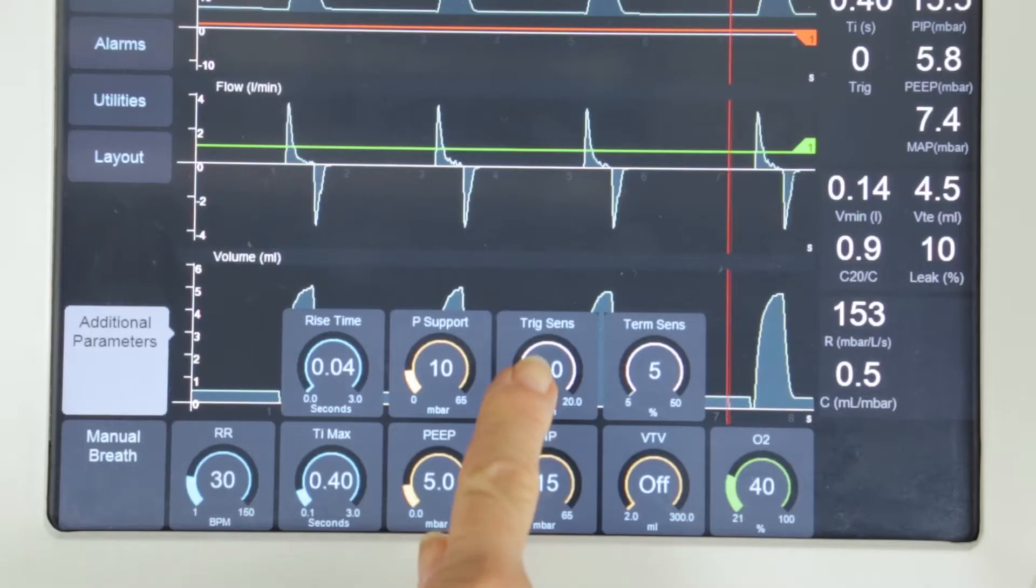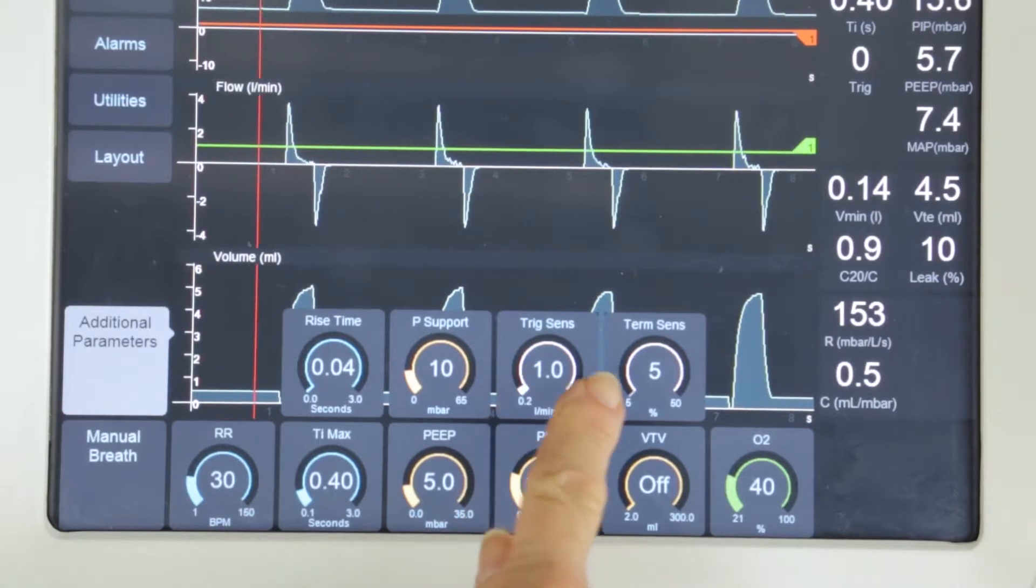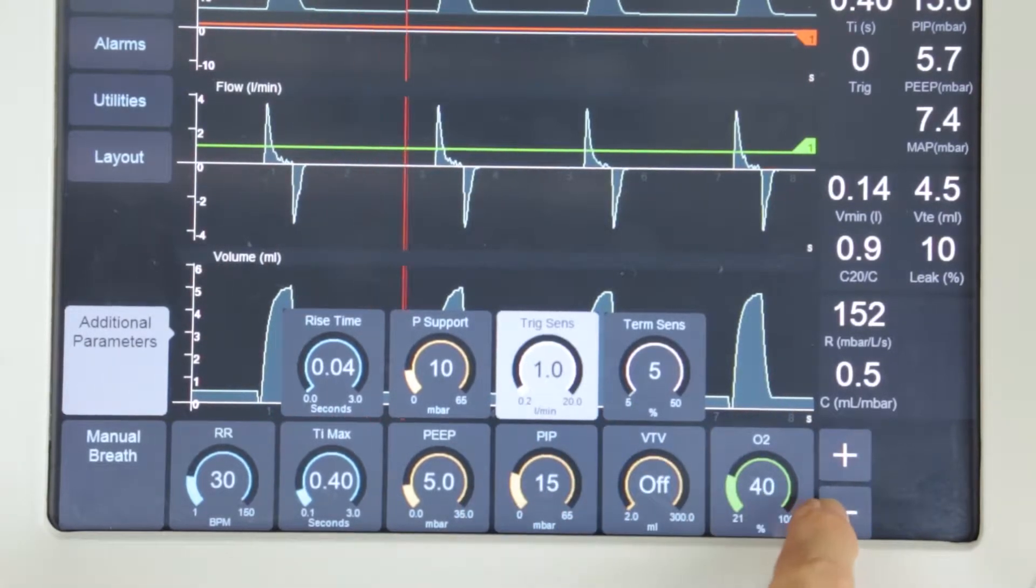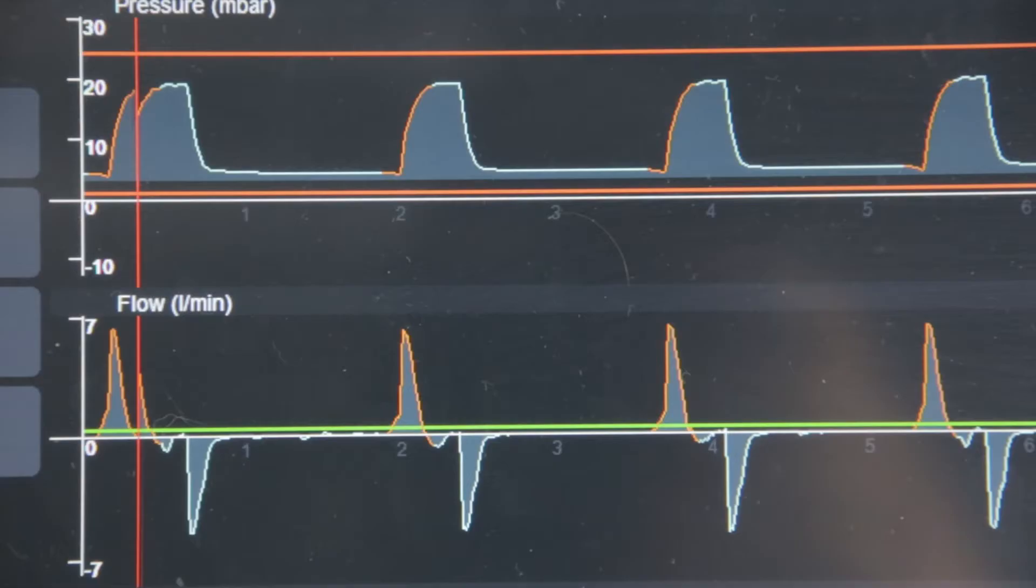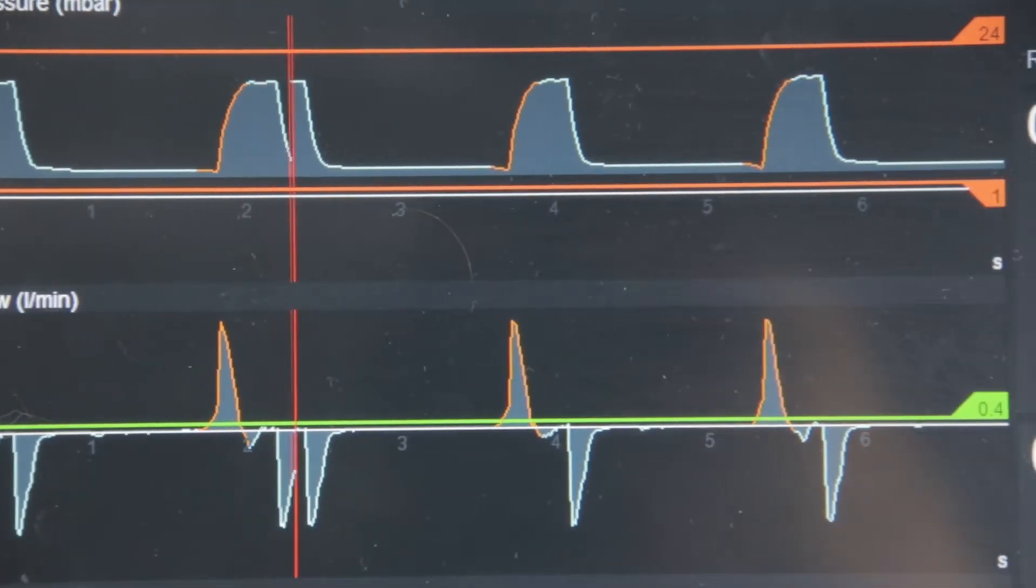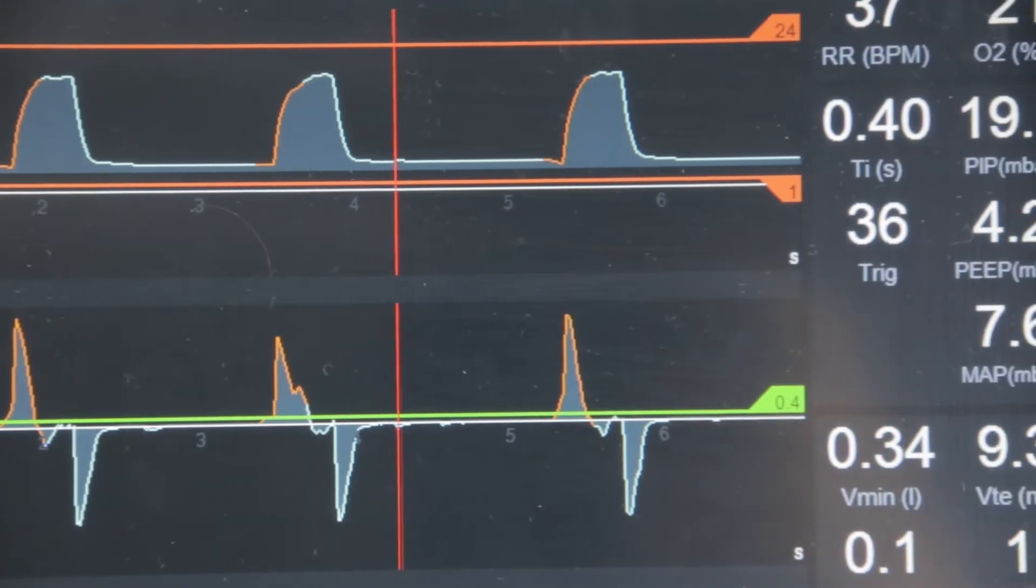Under Additional Parameters, set the inspiratory trigger threshold. The default setting is 0.6 liters per minute. Press the Confirm button once everything has been set, and ensure that the infant is actually triggering the ventilator.